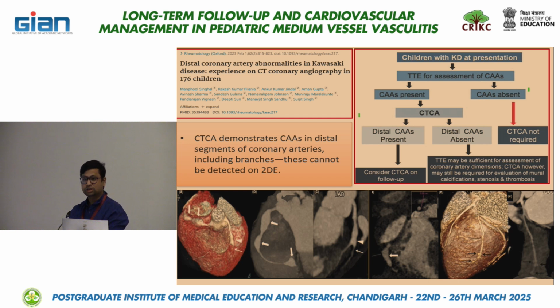But if the distal coronary artery aneurysms are absent, then TTE or 2D echocardiography may be sufficient for assessment of coronary artery dimensions. However, CTCA may still be required for the evaluation of mural changes, mural calcification, stenosis, and thrombosis.